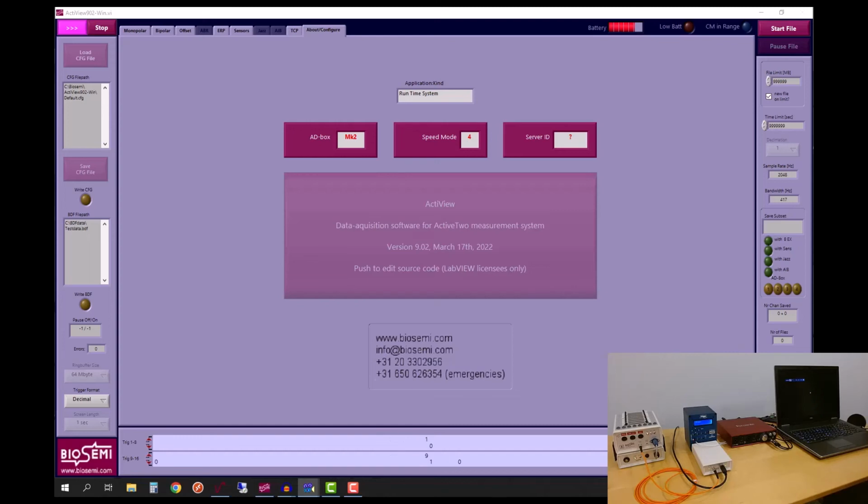On the bottom you see a couple of codes. There's 9 followed by a 1 and then a 0. So there are a couple of things happening there at once, as you recall, the 2 short codes and the 1 long code.